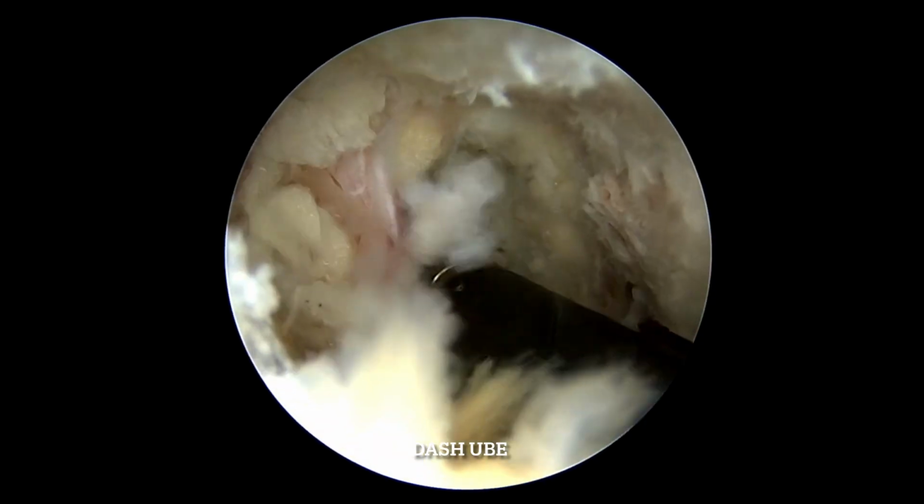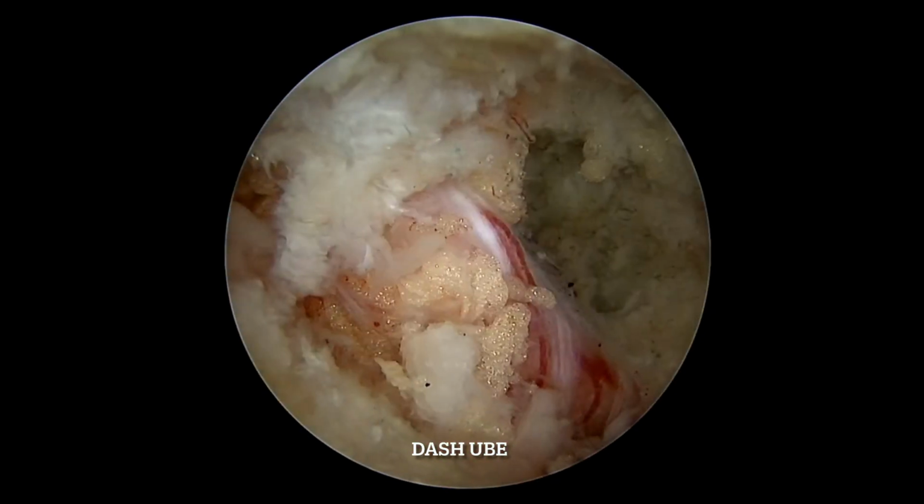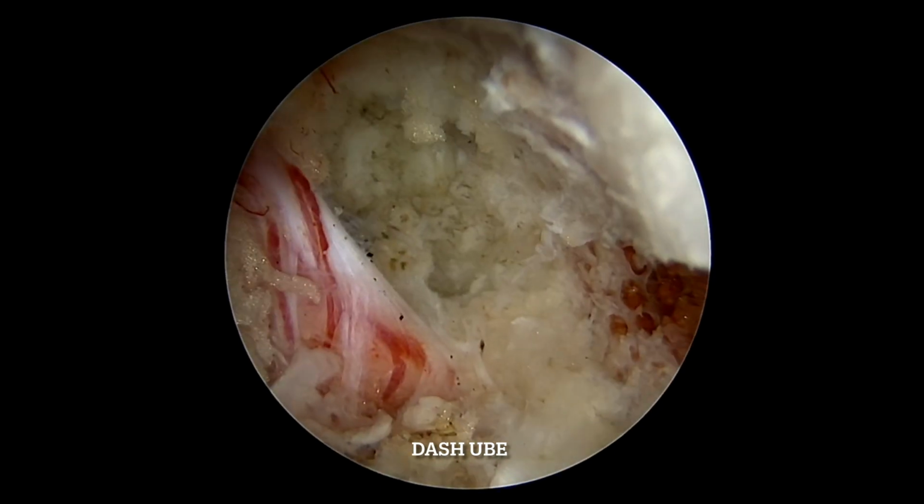I'll try to do annuloplasty at the end of the procedure, so that I'll be able to do some additional shrinkage of the tissues.